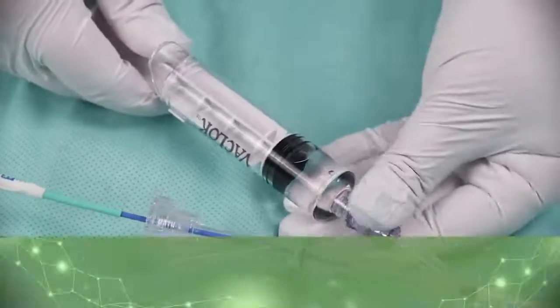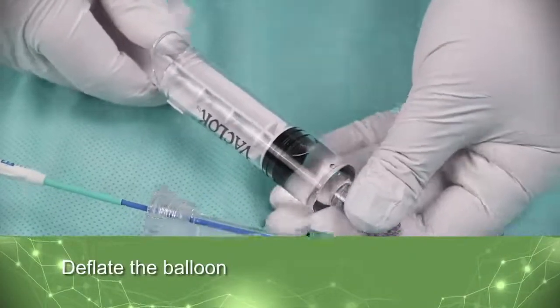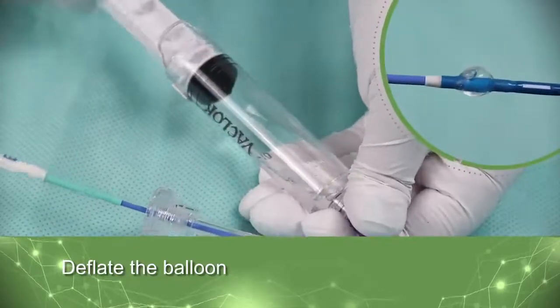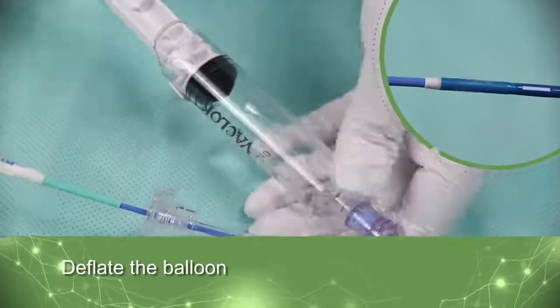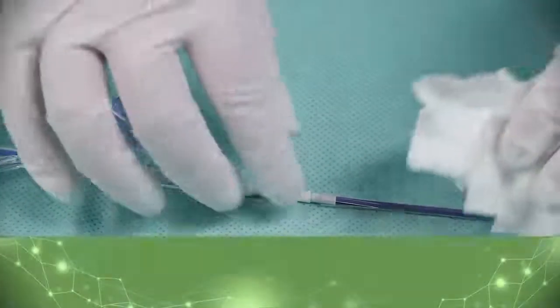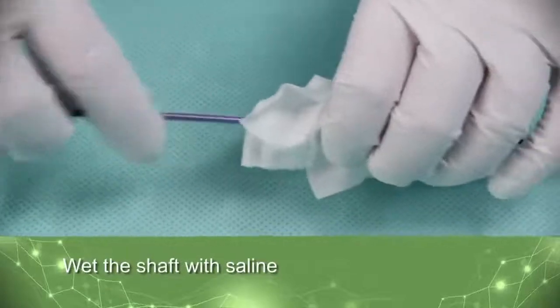Before use, deflate the balloon by reattaching the 20-milliliter syringe to the flow valve and pulling negative on the syringe plunger. Remove the syringe following deflation. Wet the shaft of the balloon guide catheter with saline.